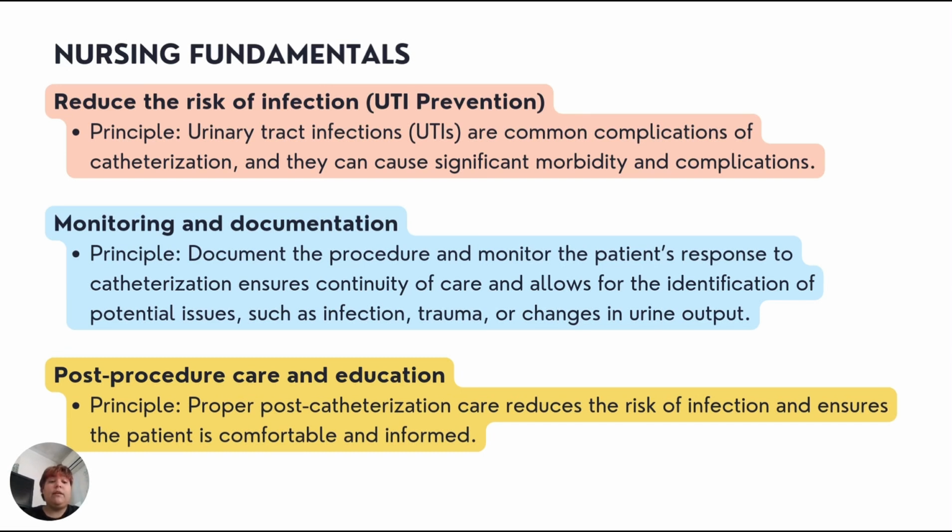Then we have the nursing fundamental of reducing the risk of infection, UTI prevention. The principle here is that UTIs are common complications of catheterization and they can cause significant morbidity and complications.